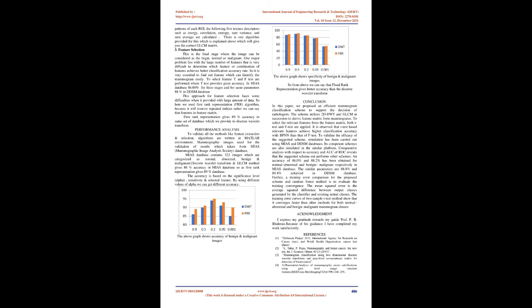Gray level co-occurrence matrix, GLCM. The gray level co-occurrence matrix, GLCM, is used to extract the texture in an image by doing the transition of gray level between 2 pixels. The GLCM gives a joint distribution of gray level pairs of neighboring pixels within an image.